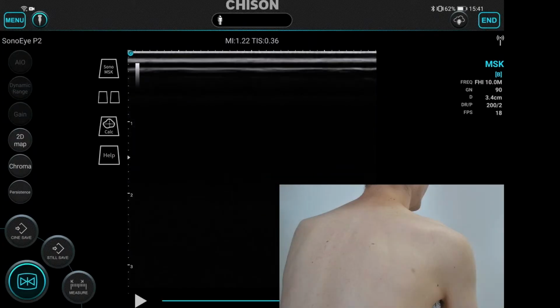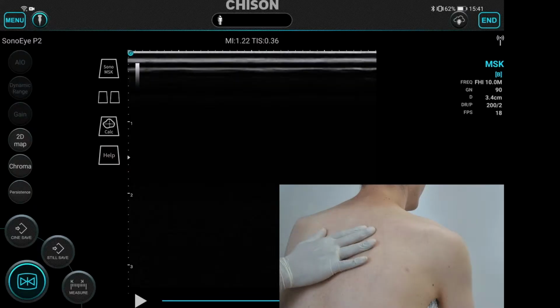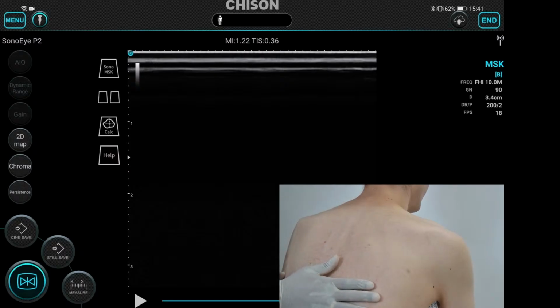Okay. So the last block which we are doing in the thoracic fascial plane block SonoEye live demonstration series is the ESP block, which is closer to the spine over here. Again, it is useful for any kind of open chest surgeries like thoracotomy. It targets majorly the thoracic spinal nerves, targeting the posterior thoracic region, lateral and anterior as well.